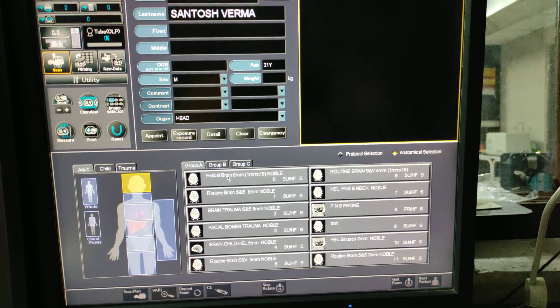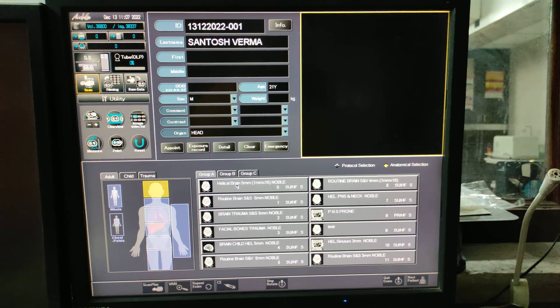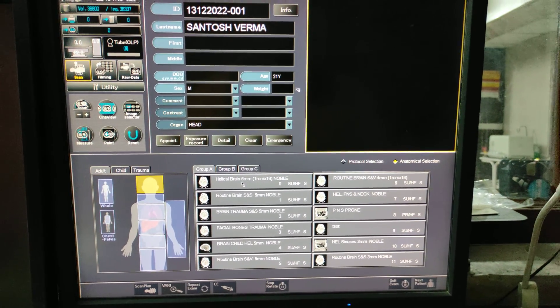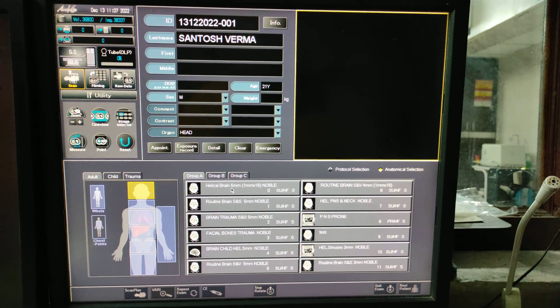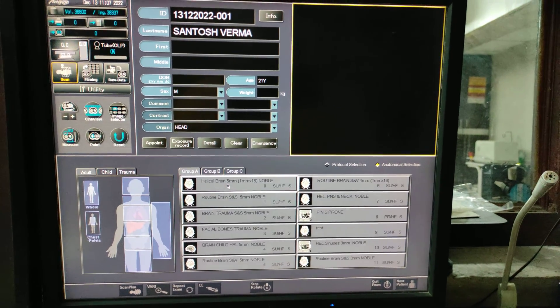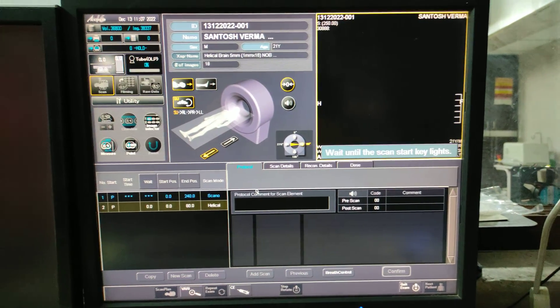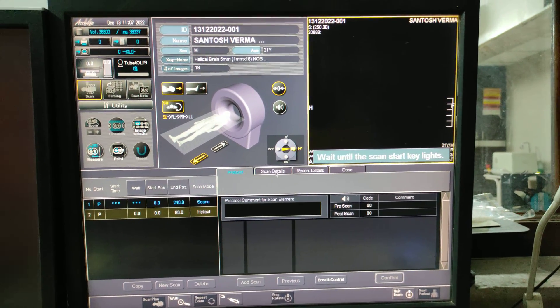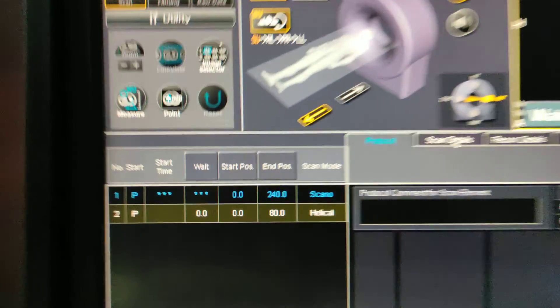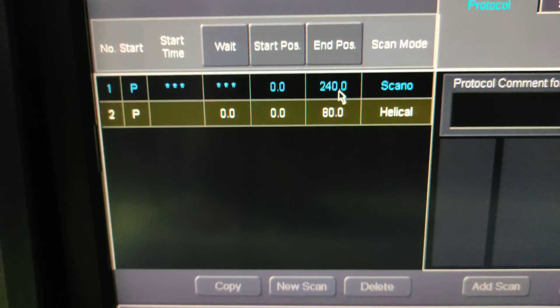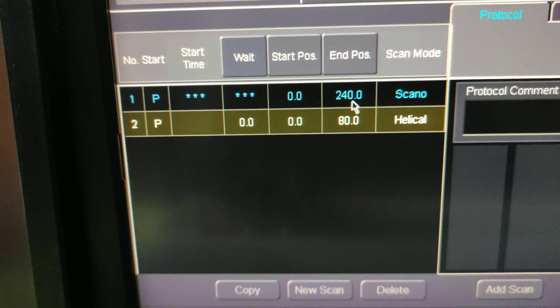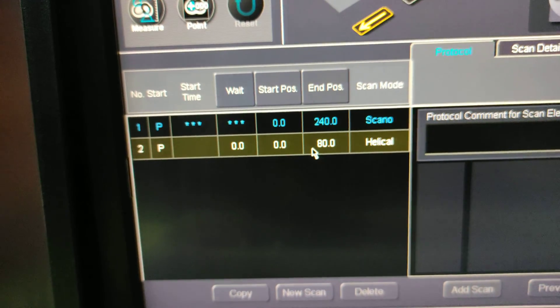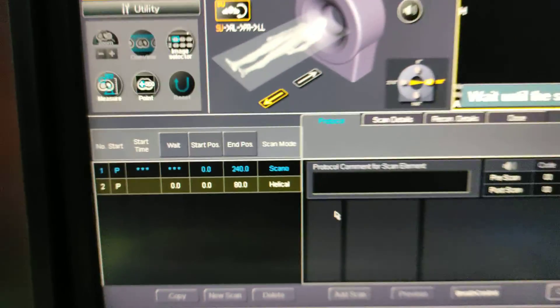Either you can take a helical scan or a standard scan. This is my protocol — I am taking this helical scan. Select it. The first series is the scanogram with a scanner length of 240, and the second series is the routine brain scan.